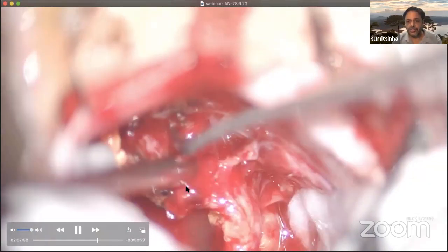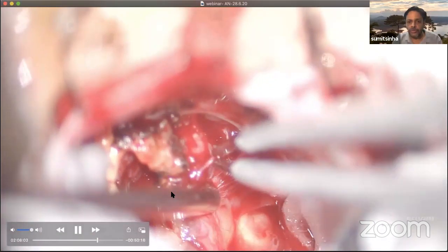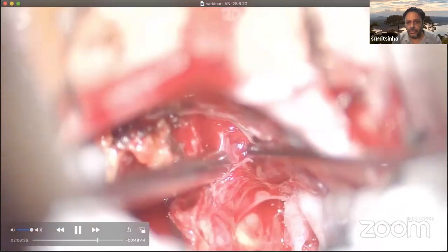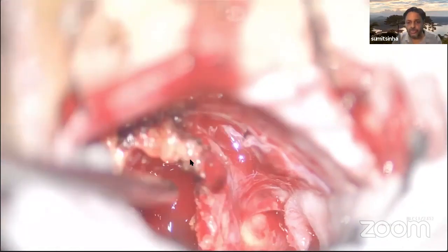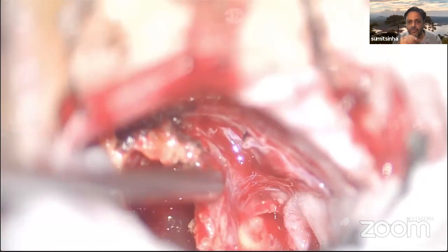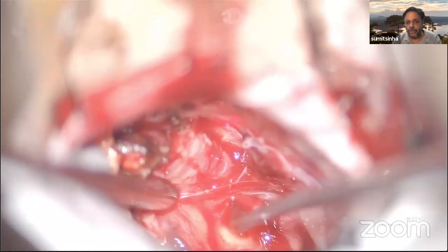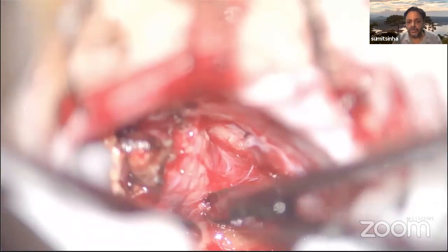Now, proceeding the dissection from the inferior pole and the lateral pole of the tumor, keeping the facial always in view, cutting the arachnoid, keeping the arachnoid apart from the tumor capsule. Stimulating the facial nerve, stimulating the tumor capsule. Now, this is the water jet dissection I did. You see that? The separation of the facial nerve away from the tumor capsule by water jet dissection is sometimes of very special help during the surgery. It is atraumatic to the facial nerve, and it serves your purpose of separating the facial nerve away from the tumor capsule. That's what you want to do. At no point during this dissection should you pull on the facial nerve, because that will injure it, with not so good results after the surgery.